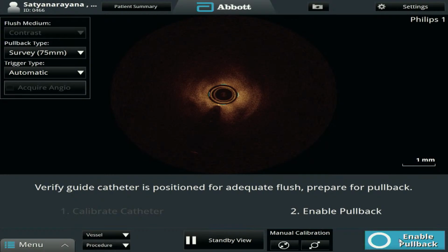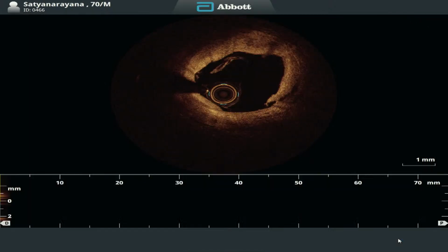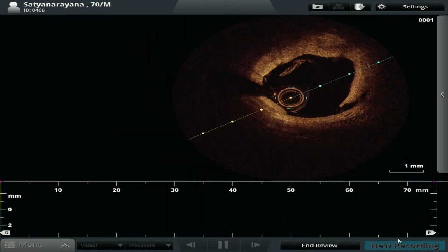Okay, ready? Are you ready? Okay, go ahead. Ready? Inject. Force. Why did it move? No, don't stop here. I told you that it will move. Artifacts stay.